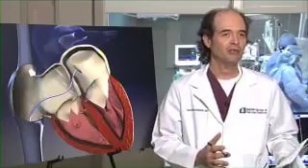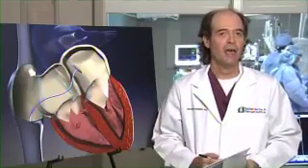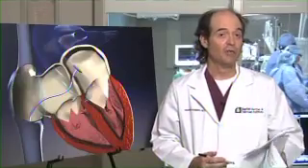This patient that you showed us is just a classic patient that I would close the PFO: a young patient that's had prior strokes and a present stroke. Are they going to stay on Coumadin for another 50 years? I agree with you. This is the patient that we should close the PFO, the one that you have on the table.